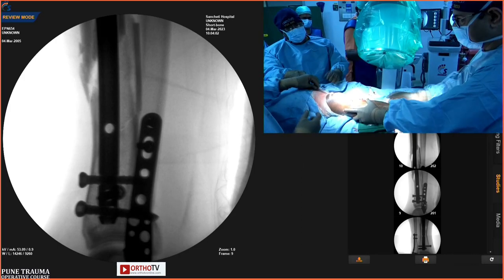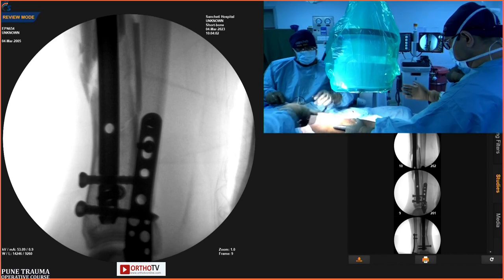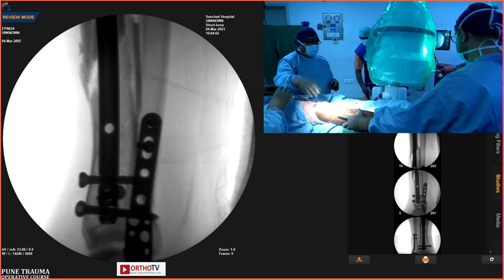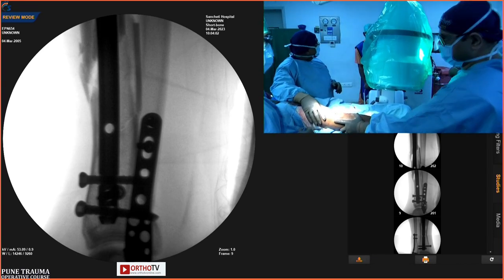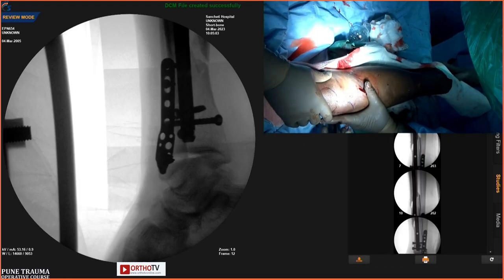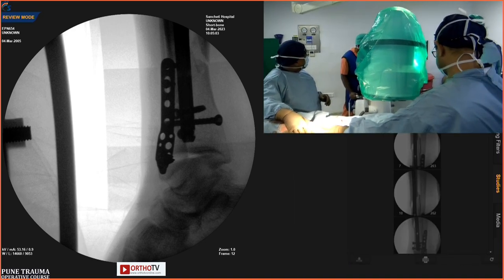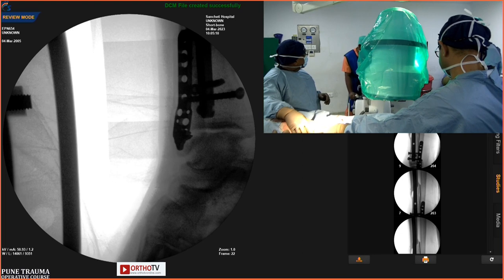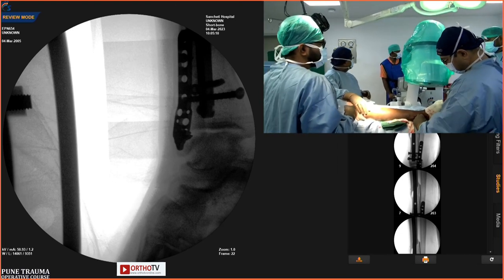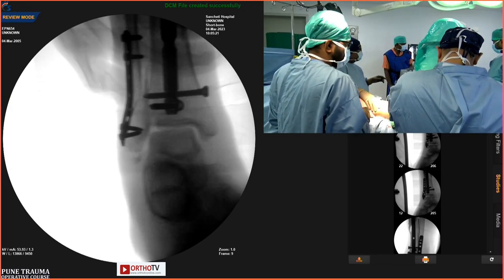I just did the last screw, and if you see this, this is the way the C-arm comes in. Come down, quick. The C-arm is kept oblique by 30 degrees, or the leg is kept oblique, because now you already have four bolts in there. And if you see this, this is how you get the round hole. Shoot. Chetan sir, do you want to see the syndesmotic stability? Yeah, the fibula is open, but the syndesmosis is stable. You can see here. You can use a hook test also.